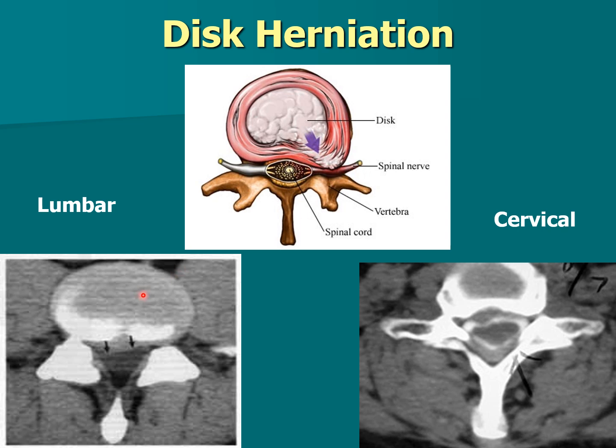If we look here, this is the lumbar area. This is a little bit of the spine itself, but this is the disc. It's not very dense, and we can see it should be straight across here, and we can see that it's angled, that disc. I do not see any contrast in the spinal canal, so this may not be post-myelogram, but you can see that disc space, this is disc here, that it's shoving here. It should be the same nice thin across here. It should go like this, and here we see it dipping down.